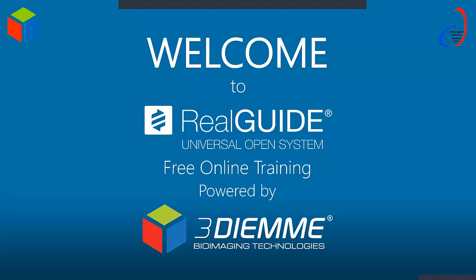Well, let's move forward to our topics with a brief introduction about who 3DM is, what Real Guide is, and how it works.